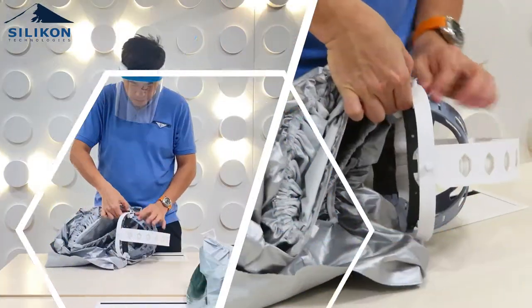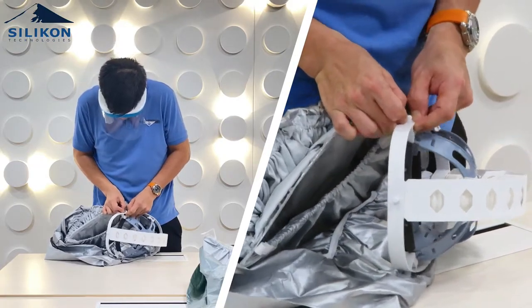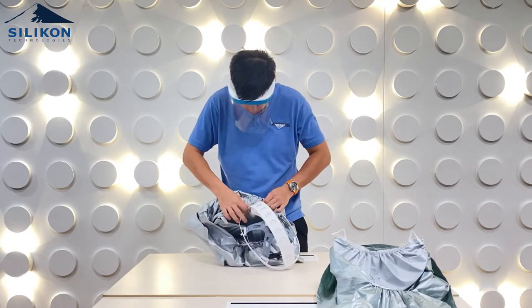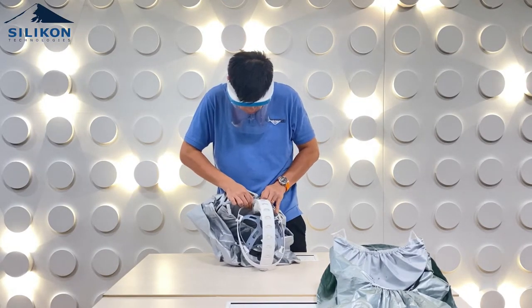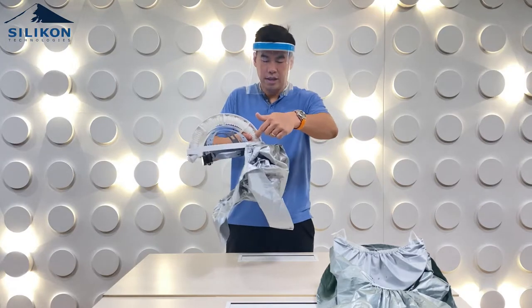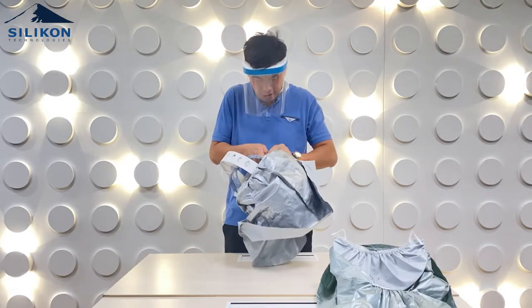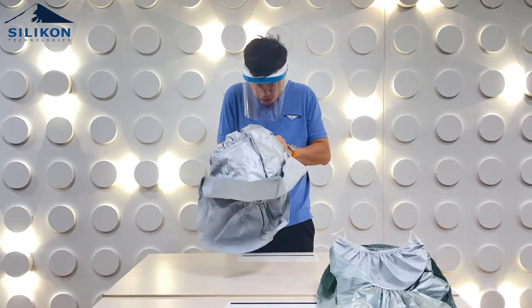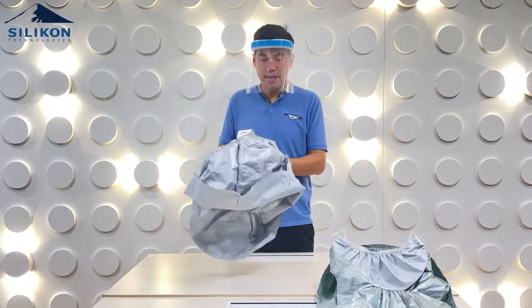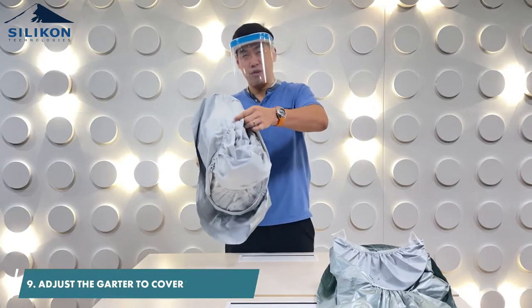It's a bit tight — you just have to push it in one hole at a time. Make sure the transparent film is always aligned to the hood frame, then go to the third one. Once it's locked into place, pull the garter over to cover the entire hood frame.